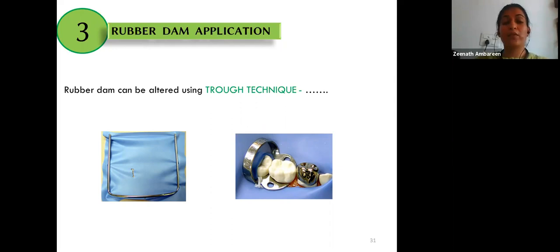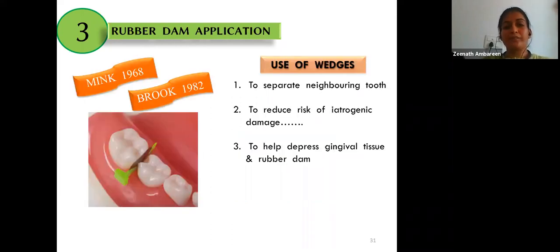When preparing the tooth under rubber dam, if the tooth to be prepared is the same tooth to be clamped, the entire reduction is done with the clamp except for the distal slice, which can be done after removing the clamp. Occlusal reduction can be checked by comparing the tooth being reduced with the adjacent tooth. Wedges can also be used to separate neighboring teeth, minimizing the risk of damaging adjacent teeth during proximal preparation and helping depress the gingival tissue and rubber dam.